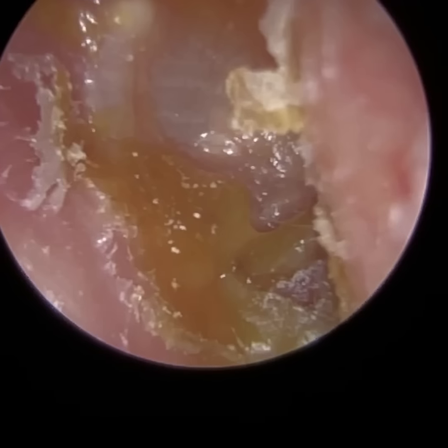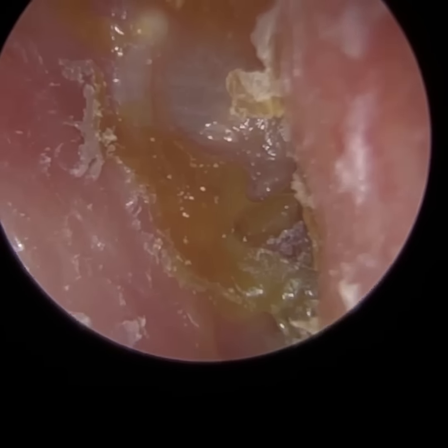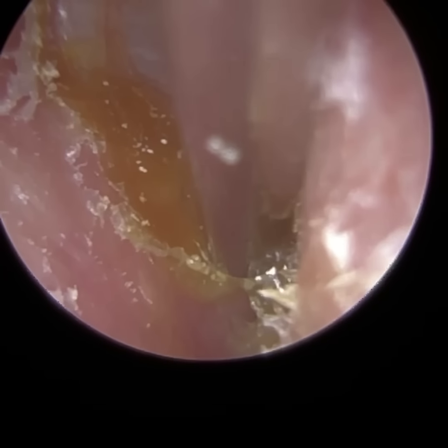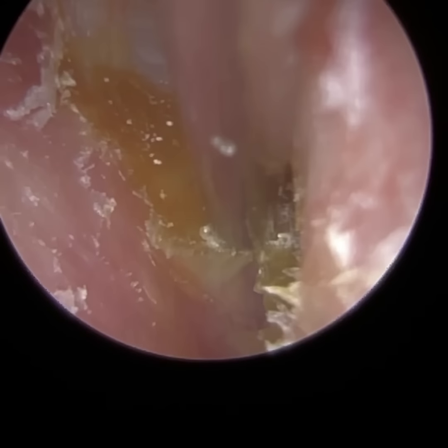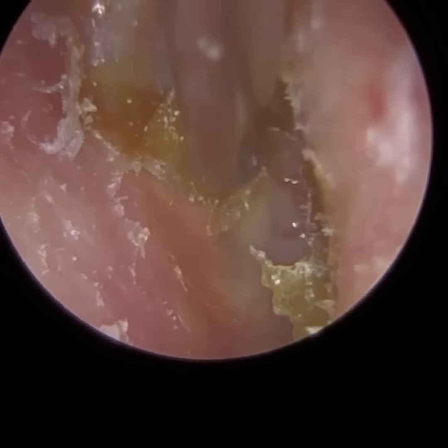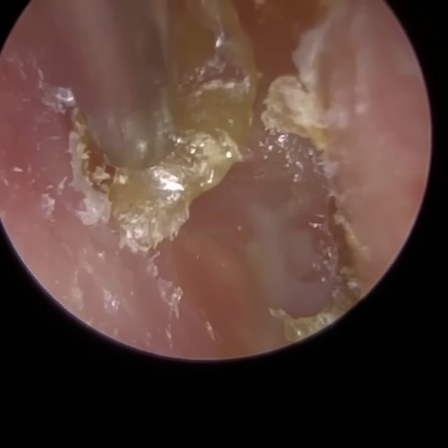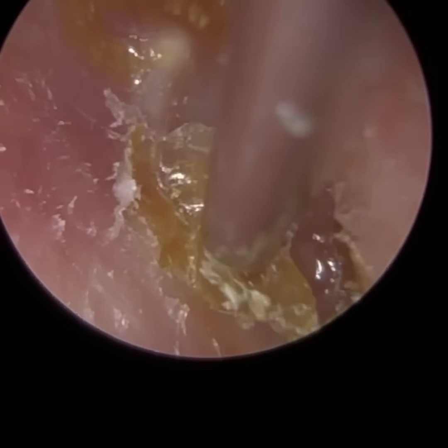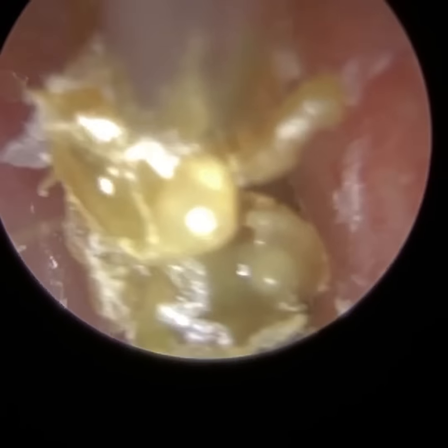Now, this skin that we've just been peeling away, and as I've been talking, you've probably seen me peeling it away off the canal wall. I've used forceps. It should naturally migrate out of the ear like a conveyor belt. And then any wax sitting on the surface of the skin is also naturally transported out of the ear. So the ear, in theory and in design, should be self-cleansing. So the skin dies and it sheds and it moves sideways out of the ear. Then you get another layer of skin that's formed underneath, and it's a continuous cycle.